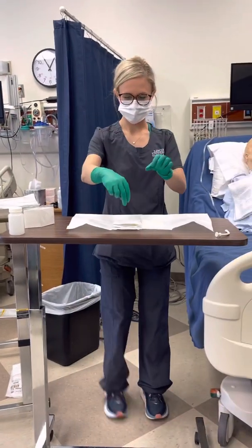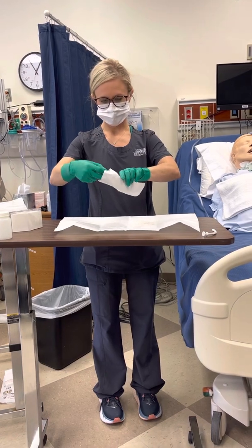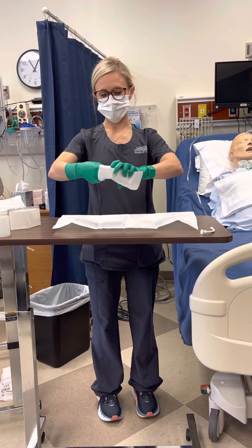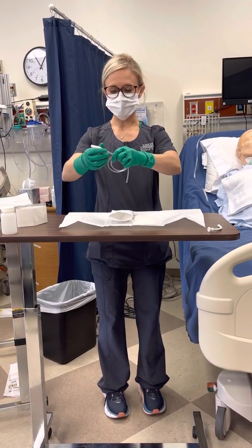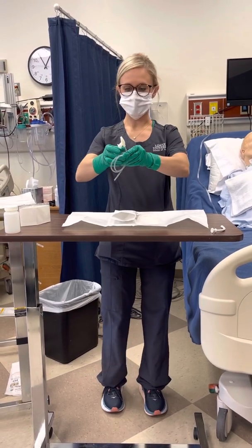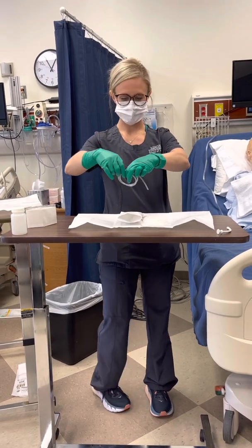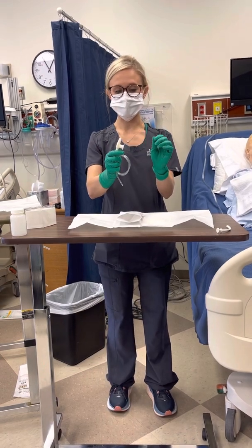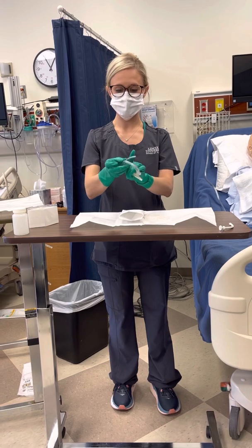Okay, I'm going to remove the suction. And when doing suction, I'm going to make sure to do intermittent suctioning for 10 to 15 seconds. When going down, I would stop the suctioning when either it meets resistance or my patient begins to cough. Okay, so now my left hand is going to become my dirty hand while my right hand is my sterile hand.